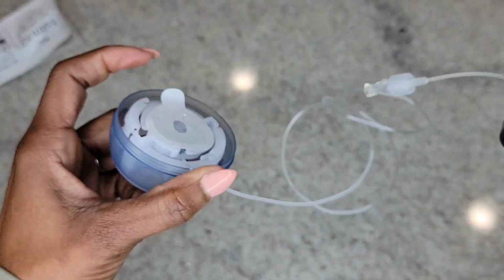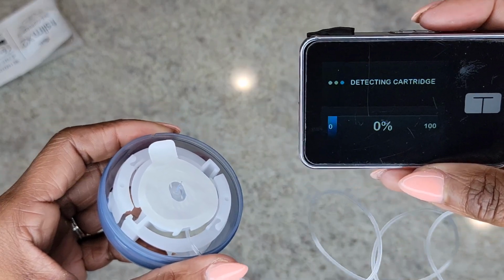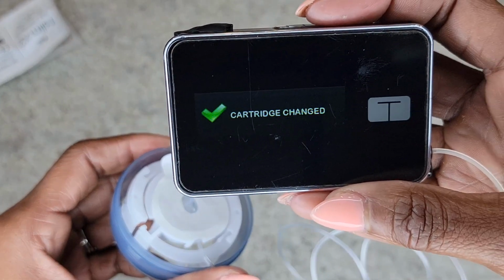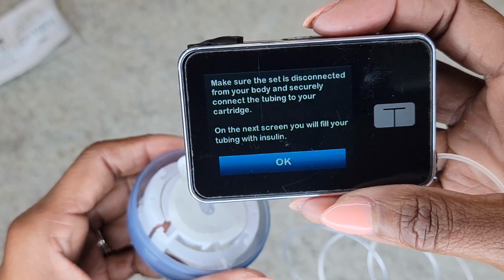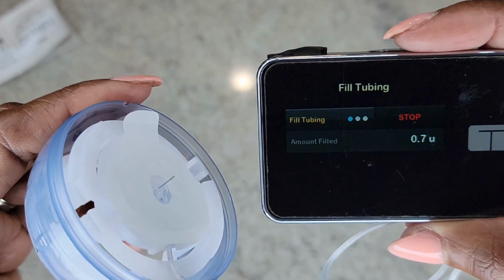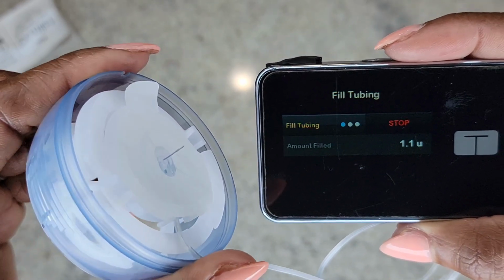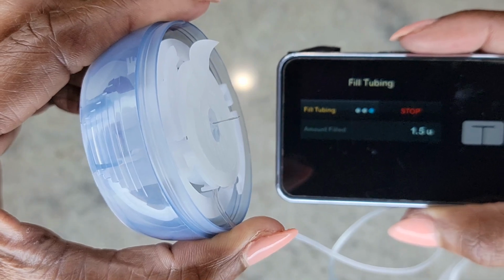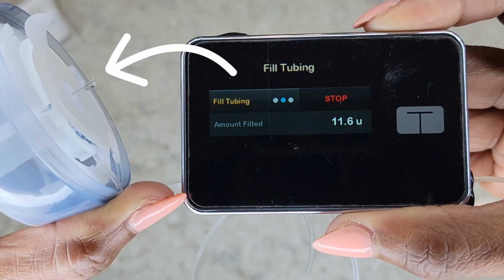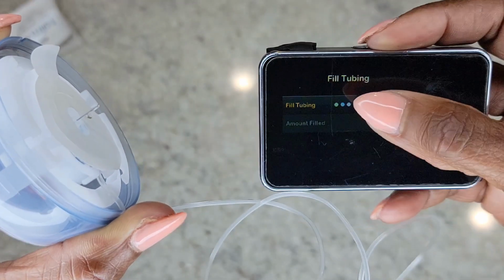Okay, so it is detecting the cartridge right now, and that takes a few seconds. Boom, cartridge has been changed. It detected tubing. I'm gonna hit that start button. It has to go at least 10 units before we start seeing any drops come out of the end here. Oop, y'all see that? We got action, so we can stop it.